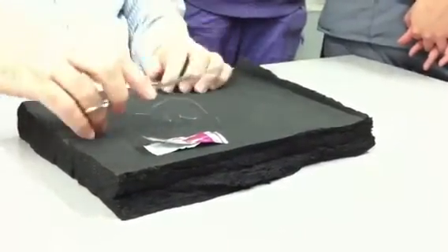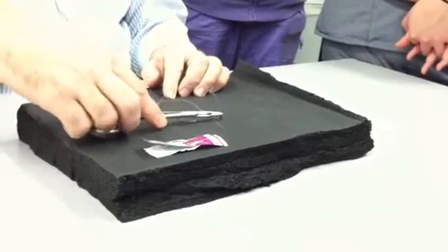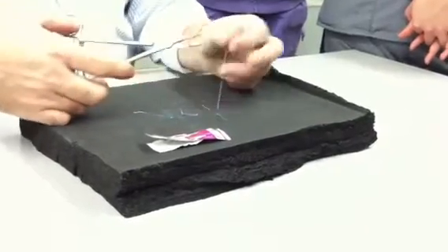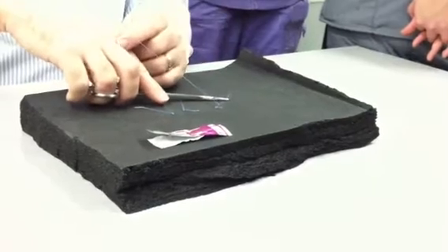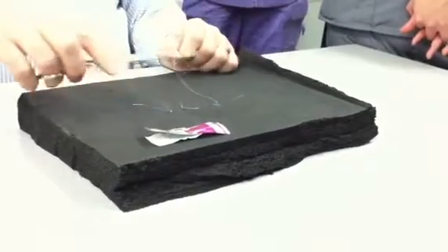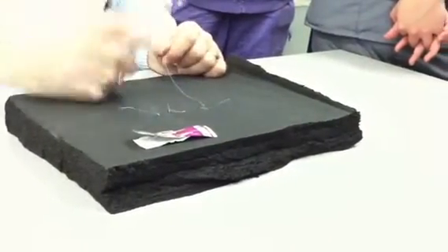So my next bite for this stitch is to do the exact same forehand, curl out. Now when I tie these two together, I made the cruciate — the cross mattress or cruciate mattress. Cruciate or cross mattress is forehand followed by forehand.